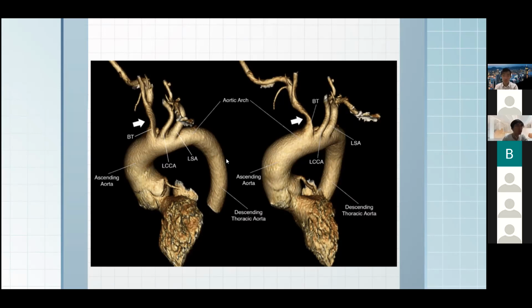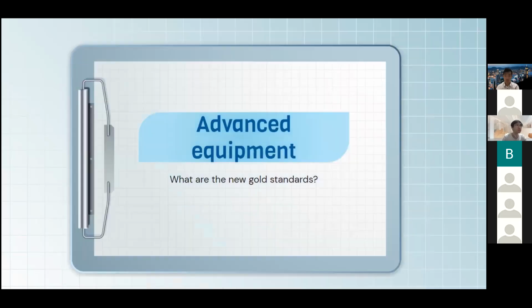So this will be very useful since I've mentioned most of the previous angiograms are only presented in 2D. With 3D reconstruction, you can actually have a look at the different narrowing sites from different angles that might otherwise be occluded when you are actually looking at a 2D image.